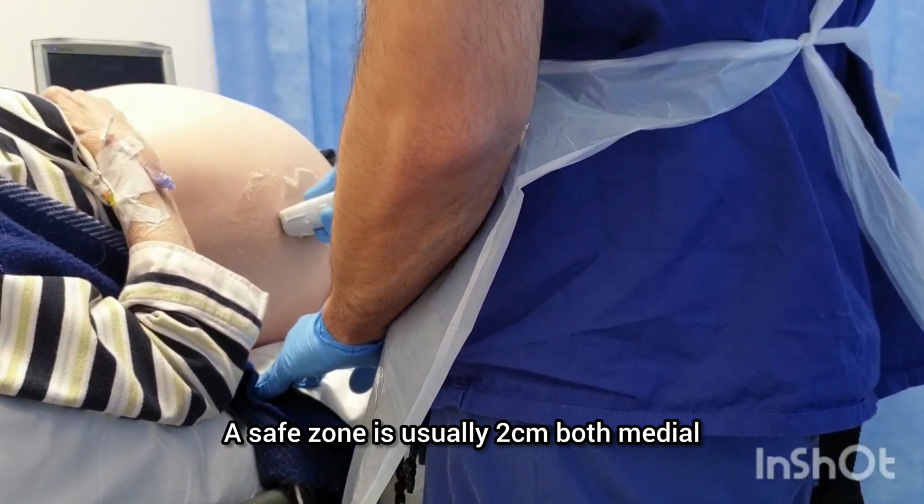After allowing some time for the local anesthetic to take effect, you will perform an ascitic tap. This has several functions. It increases the volume of ascitic fluid for analysis, gives an idea of how well your insertion site is anesthetized, and most importantly, it reconfirms the safety of your insertion site. In order to introduce your blunt-ended rocket drain, use your scalpel to prime the insertion site with a small, superficial 3 to 4 millimeter width incision.